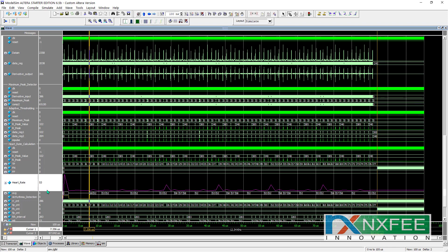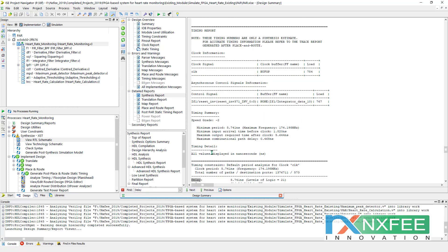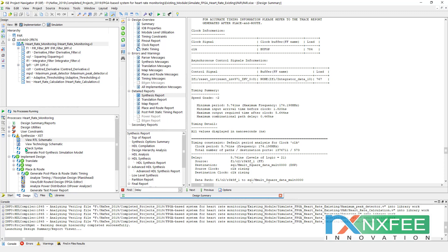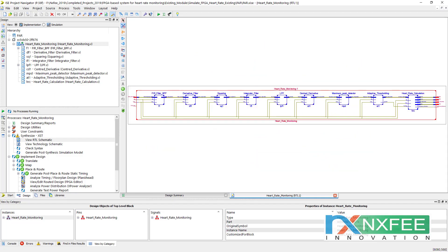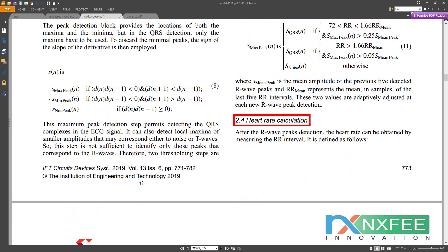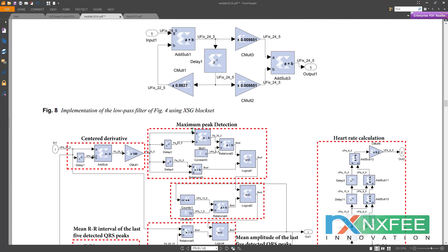The heart rate calculation computes R-to-R intervals to determine arrhythmia detection. This work was synthesized on the Xilinx Vertex 5 FPGA. The synthesis report shows the number of slice registers, flip-flops, LUTs, occupied slices, and IO usage. The delay is 5.74 nanoseconds. The RTL schematic shows ECG data as input, with F1, FP, TP, and heart rate as outputs.